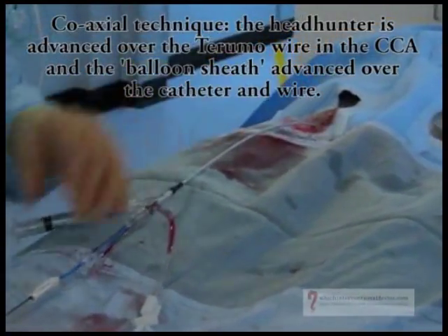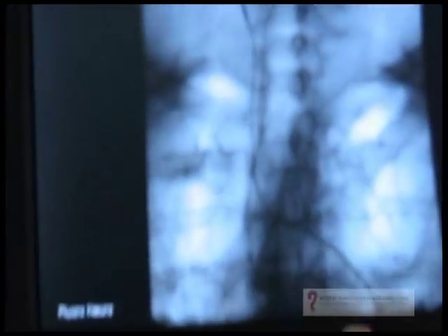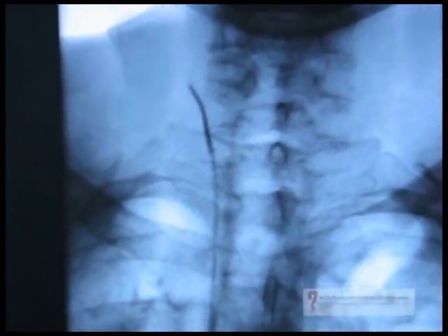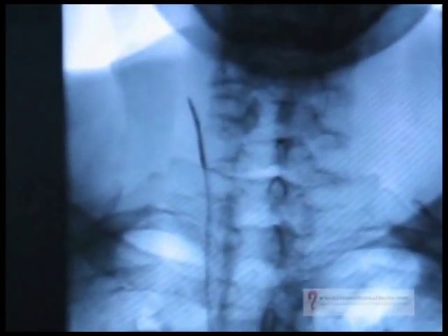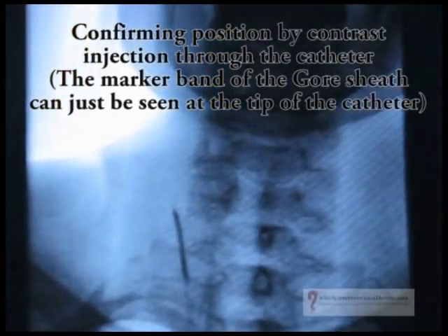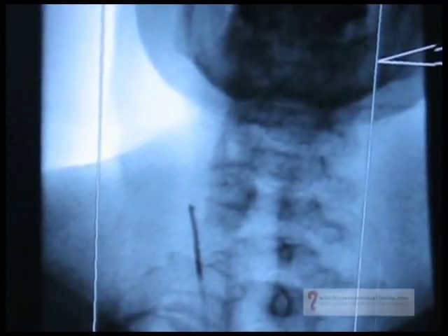This is the coaxial technique. With the Terumo wire in the carotid artery, the 125 cm 6.5 French headhunter and the sheath have been placed coaxially. You can see the markers on the end of the sheath that have come across the artery. What we do now is just check that we're happy in the position by injecting through the catheter. We can take the wire out. Can we go north now please? That's good. A bit further north? Carla, that's great. Mike, I'm going to get a bit of warmth coming up the right side of your face now.